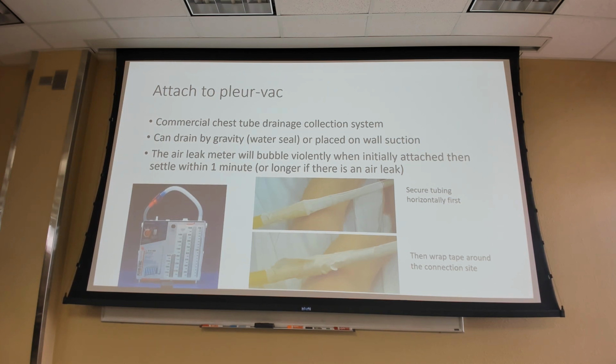Yes, you can push back in. Yep. We'll typically have to take all the dressings down. No, we don't put a new tube in. We typically just insert that tube back into there. And that's why we're typically giving them some sort of prophylactic antibiotics as well, one to avoid any sort of pneumonia, but also to cover for any of that skin flora that can become infected and create cellulitis in that wound area.